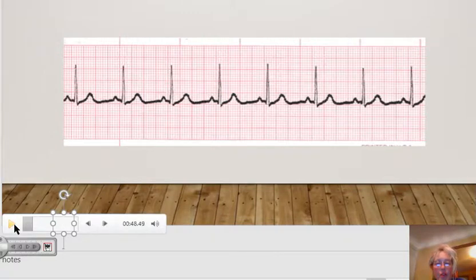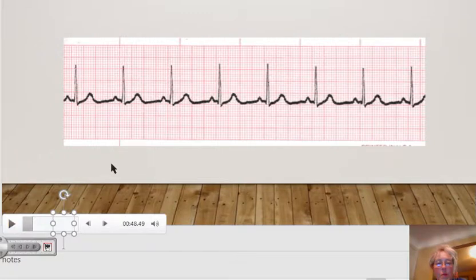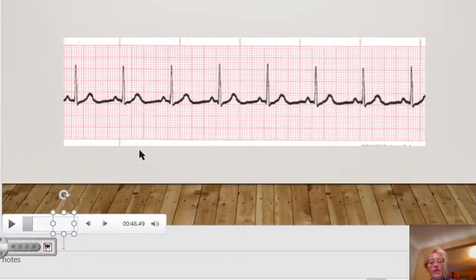Okay, how did you do? If you guessed that it was a normal sinus rhythm, you'd be correct.